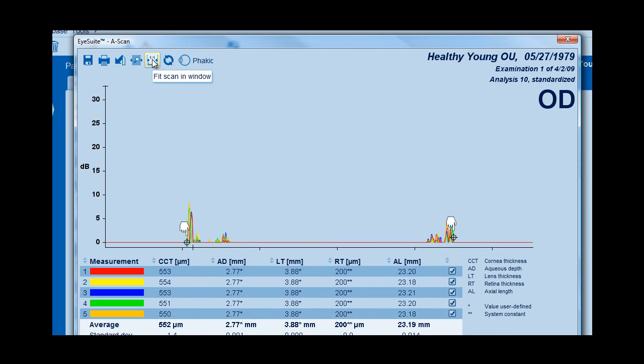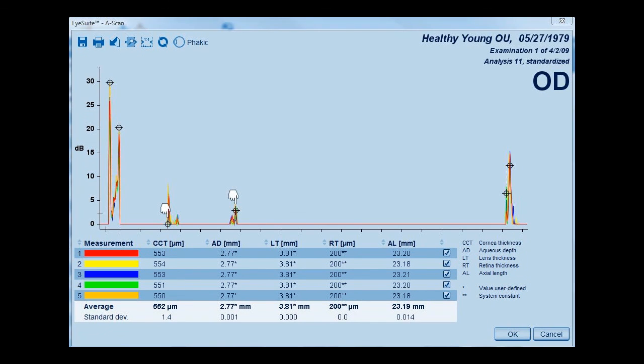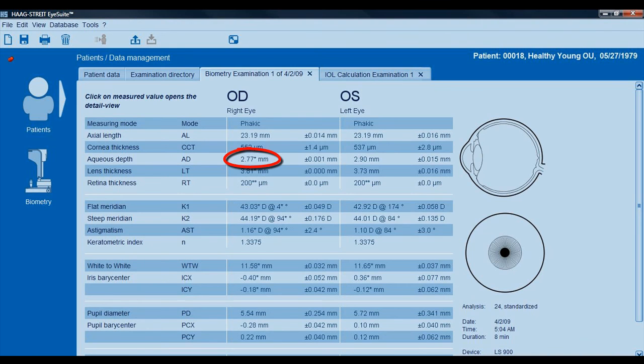To exit the magnification screen, simply press the icon labeled 1 to 1. Adjusted results will have the notation of a hand pointing down. They will also be displayed with an asterisk on both the A-scan screen as well as the results overview page. Right and left eye measurements will open independently.